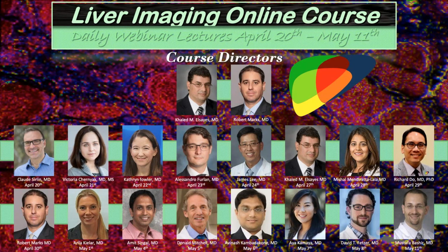If the purpose of the other exam is to get complementary value, then you'll get more complementary value from doing a different exam. So when we do 6-month interval imaging, most likely we're going to be doing the same imaging method to look for interval change. When we do more rapid imaging, there's a higher likelihood we may switch method to get the added complementary value. Does that help address your question? Yes, it does. Thanks.